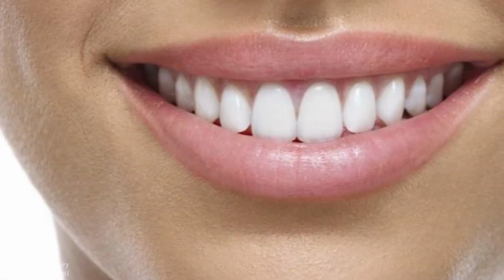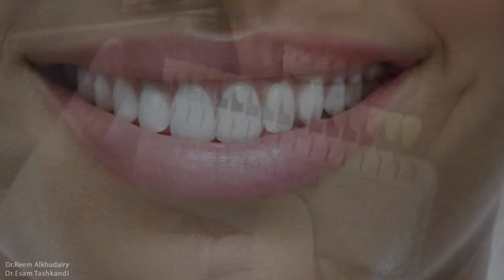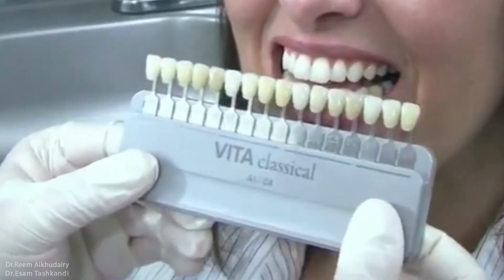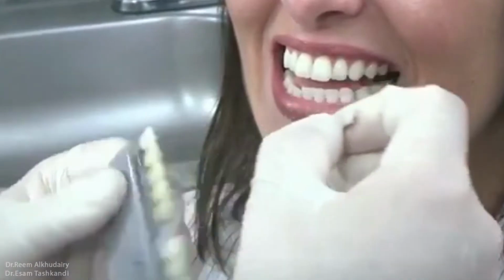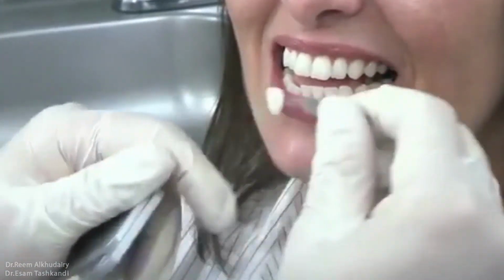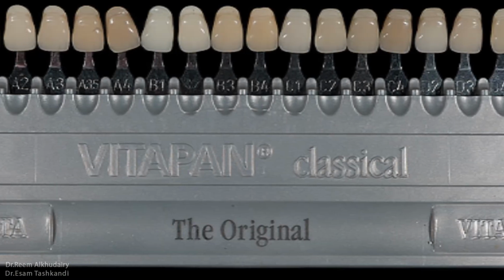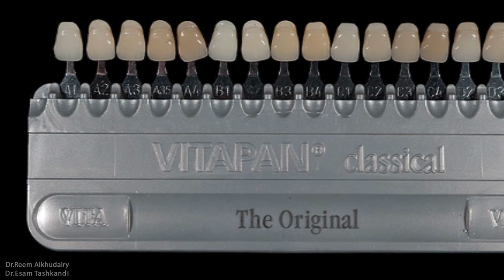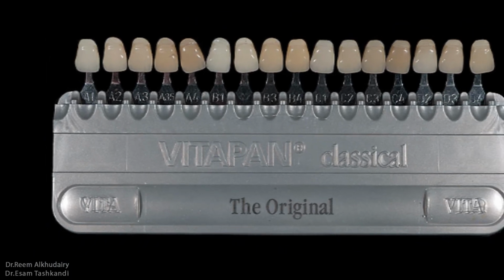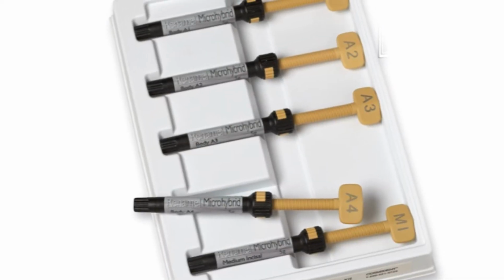In dentistry, tooth color assessment can be done through visual or instrumental methods. The visual shade matching is basically a comparison between a tooth and multiple standards, shade guide tabs. It is a convenient and the most frequently used method in clinical dentistry. The first attempt to create a universal standard for teeth color was in the mid-1950s, when the Vitapan Classical shade guide system was introduced. It has been and still is widely used as the gold standard for shade matching, and some restorative materials are keyed to it.